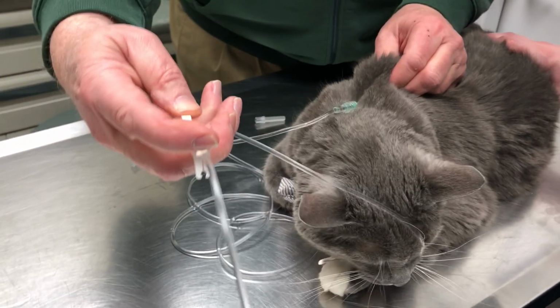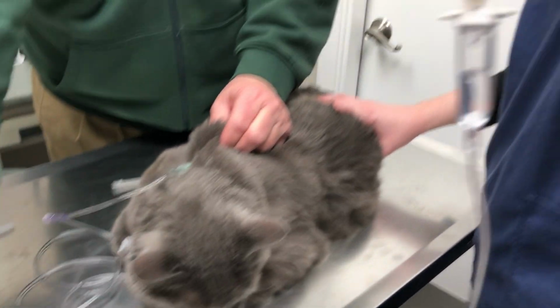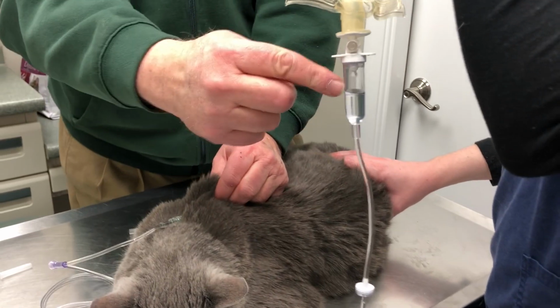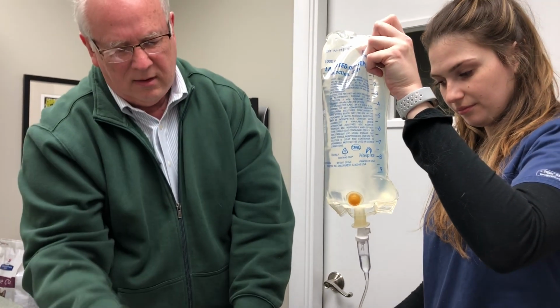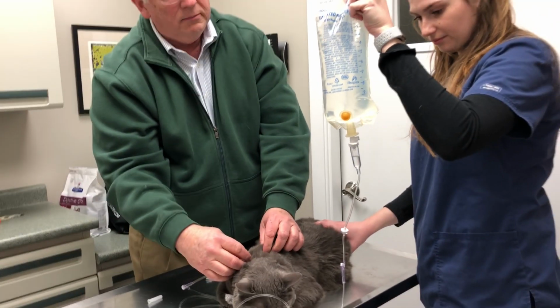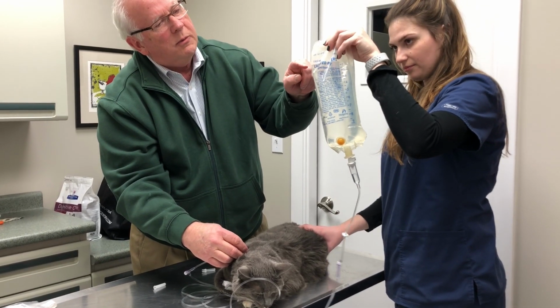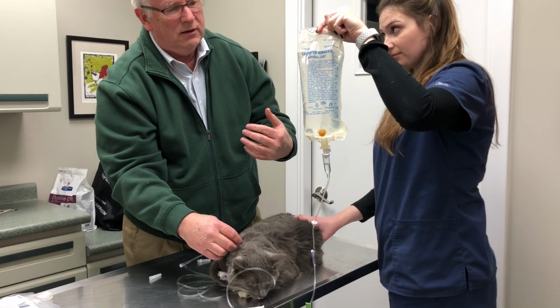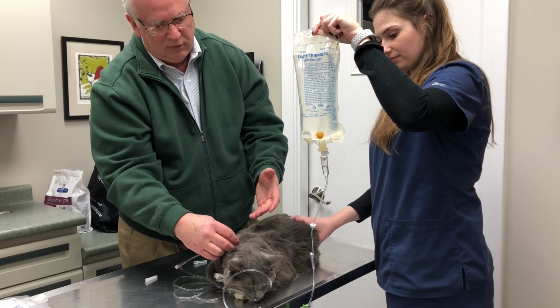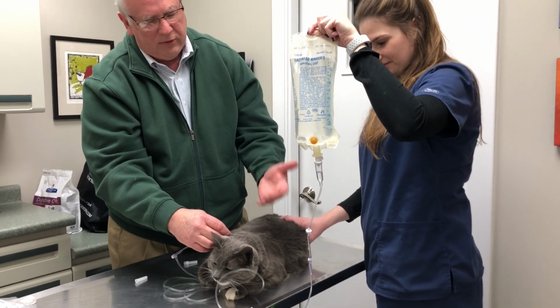Now we just open the fluids up right there. So we're going to open it all the way, and you can see on my IV stand Kirby how it's dripping, and it's dripping underneath the skin. And what we're going to do with Manny is a lot of times we probably do 100 to 150 cc's per administration for most cats. Today we're just going to use Manny as a very nice demo unit here. So that's how we do it.